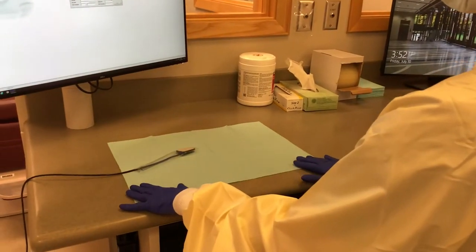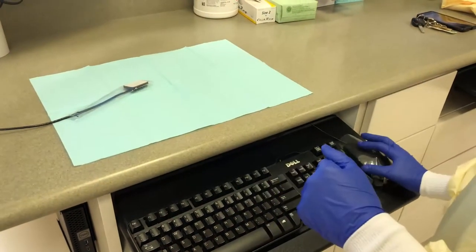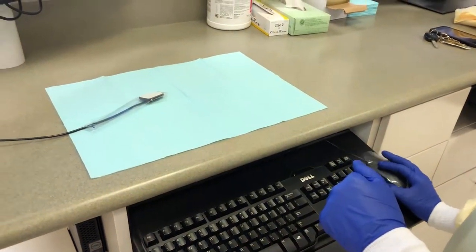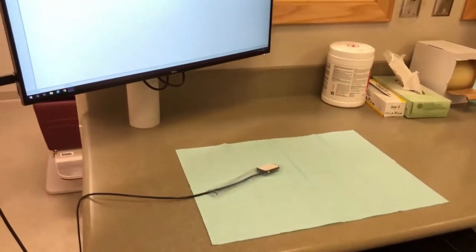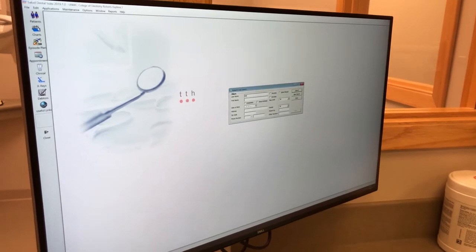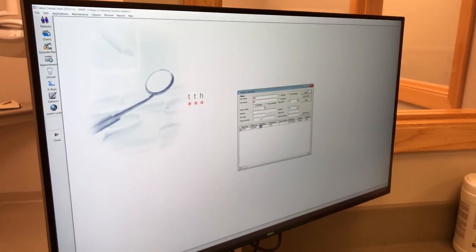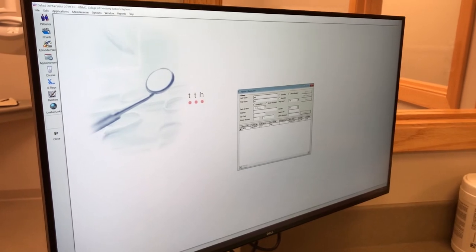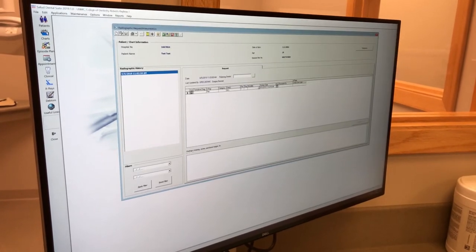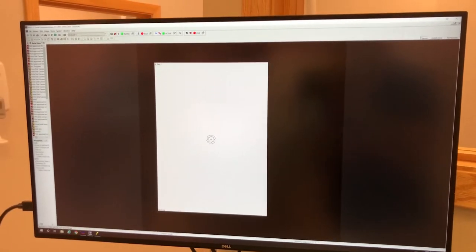First, appropriately set up your operatory and ensure you are wearing personal protective equipment. Now that setup is complete, access the patient's Salud. Click the button on the left side of the screen that says X-rays. This will pull up a screen that allows you to access previous radiographs or take additional radiographs. On the upper right-hand side, click the radiographs button. This takes you to the area where you can actually take the radiographs.